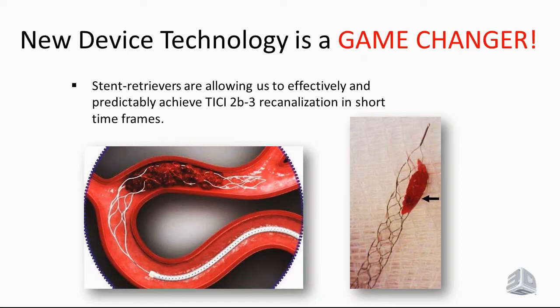I can remember telling my colleagues this, that these stent retrievers seem to be all the difference in the world, to the point that in the first few times you tried them, you really didn't believe that this was going to keep up. And in fact, the ability to actually mechanically reopen the vessel has turned out to be a pretty regular occurrence. The question is, did you get the patient in time? That is always the question.